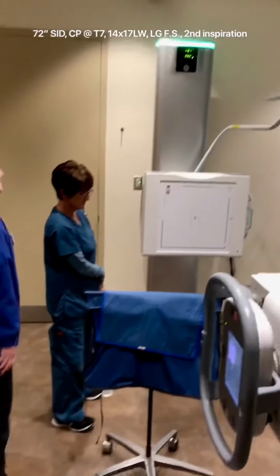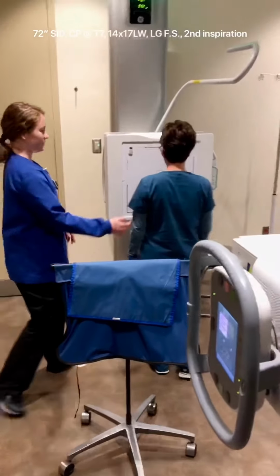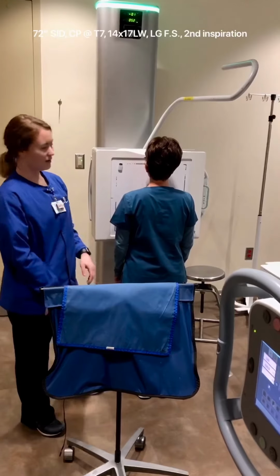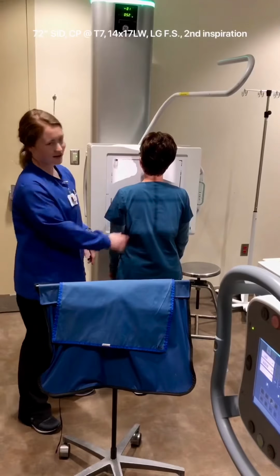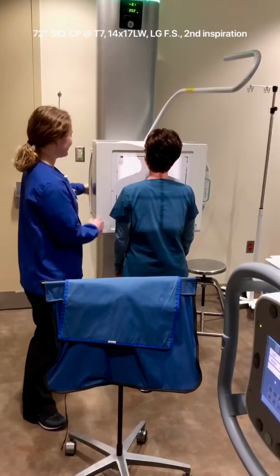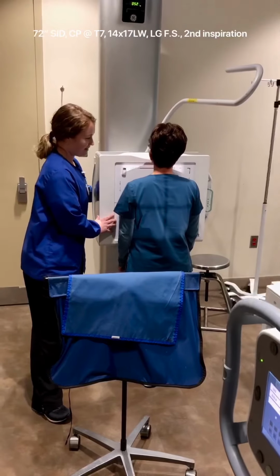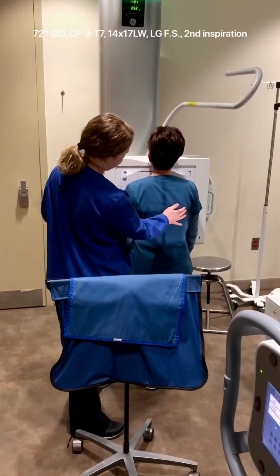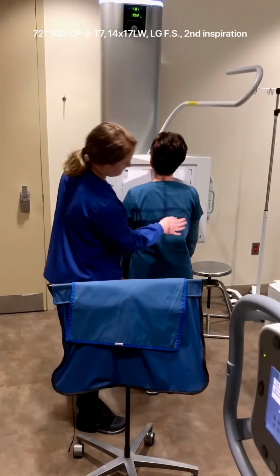So you're going to take your patient and have them stand in front of the board with their chest facing the board. Then the centering point is your inferior angle of your scapula, or at T7. So you'll bring that down. You go up all the way so you're touching the board. So right there is her inferior angle.